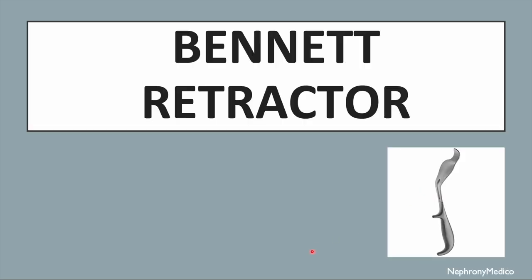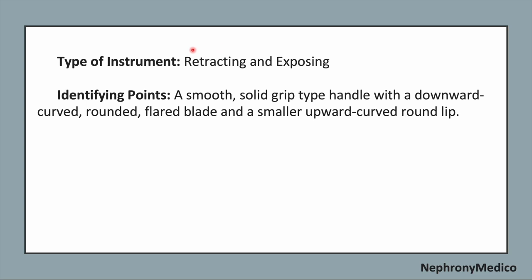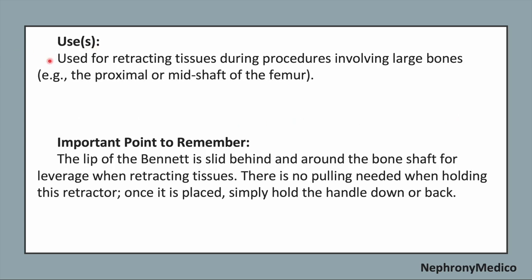Let's talk about Bennett retractor. This is a picture showing Bennett retractor. It is a retracting and exposing type of instrument. Identifying points. A smooth solid grip type handle with a downward curved rounded flared blade and a smaller upward curved round lip. Use. It is used for retracting tissues during procedures involving large bones like the proximal or the midshaft of the femur.